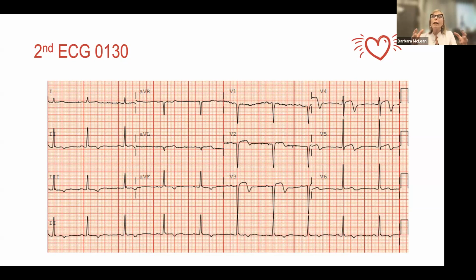And I'm really trying to find something in the EKG that's going to be meaningful to me. But even the coving of the PR segment looks better now. And remember, that coving, that little downward cove of the PR segment, can indicate pericardial effusion. It can indicate pulmonary embolism. So we're going to use that. And what he looked like before, I was thinking, oh, maybe this might be a PE. There, we've got some other issues.